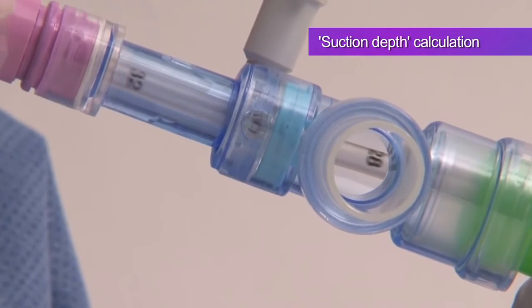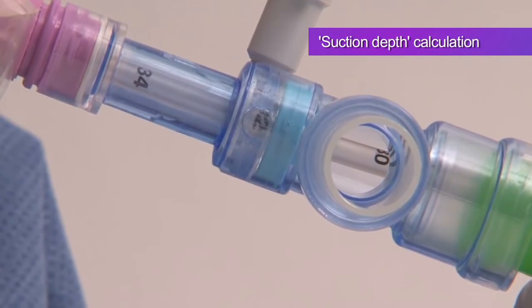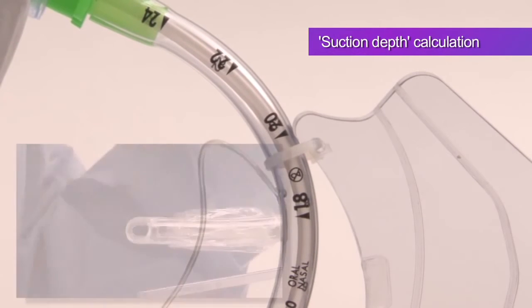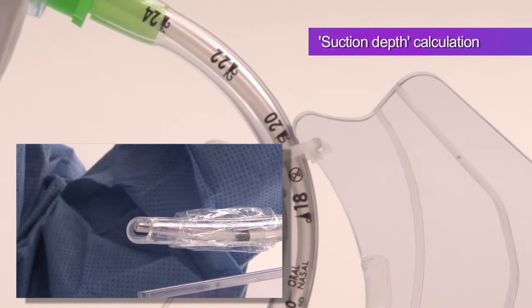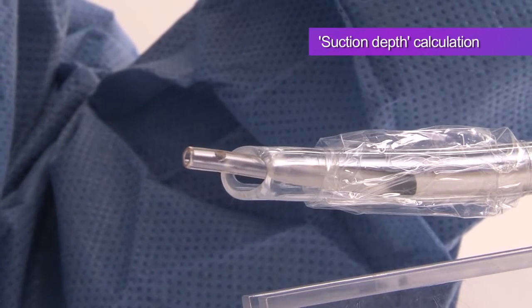Advance the catheter until 32 is seen in the window directly across from the irrigation port connector. An alternative method to calculate the depth of suction is as follows: match the visible marker numbers of the ET tube with depth markers on the suction catheter. When the numbers are equal, the tip of the suction catheter is at the end of the ET tube. Then add 1 or 2cm. This is the safest method.